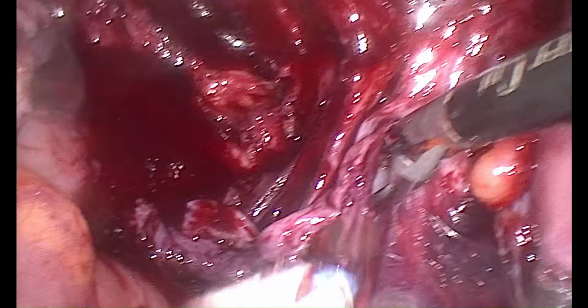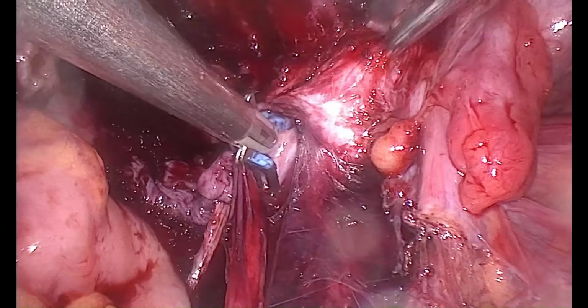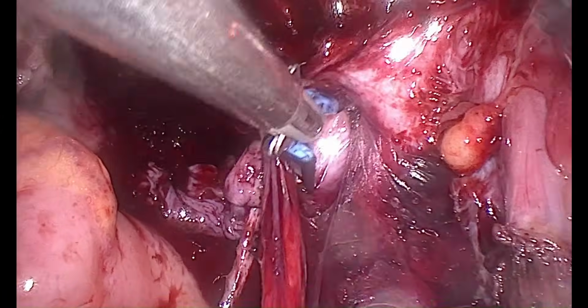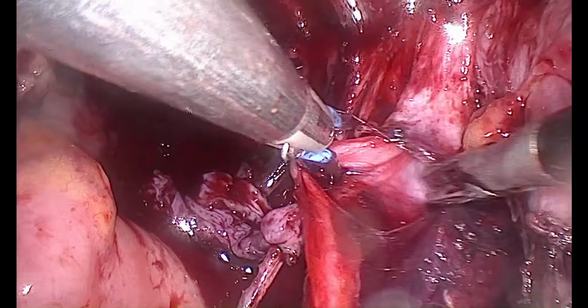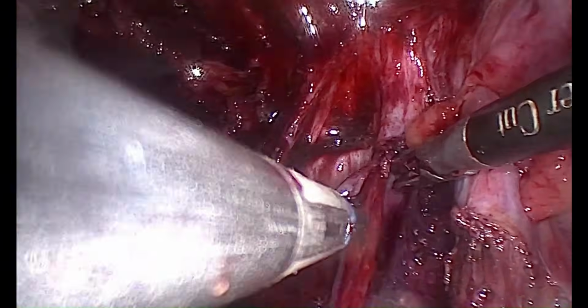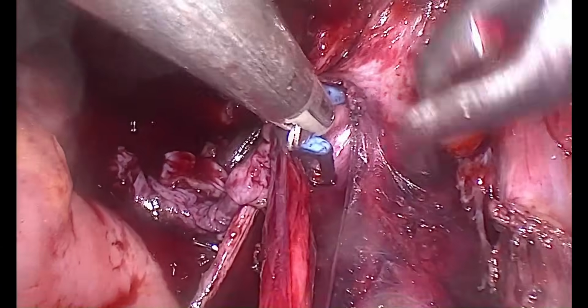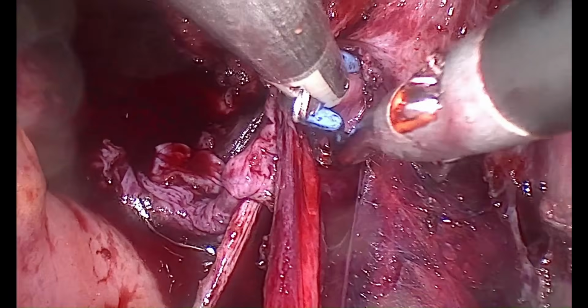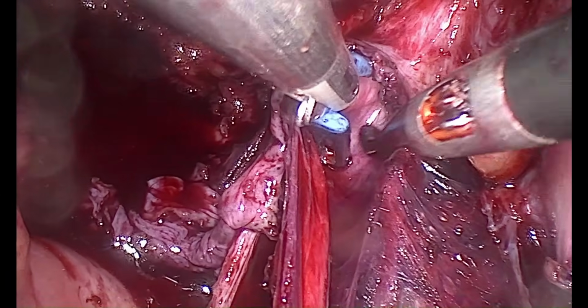You can see again I am going parallel in this particular way, and this is the way where you need to be parallel to the ureter and not perpendicular to the ureter. So this is the parallel dissection which is going on, and you can see this is the puckered peritoneum. Now I am going to take care of this puckered peritoneum, and take care of the ureter. The ureter is always under vision.